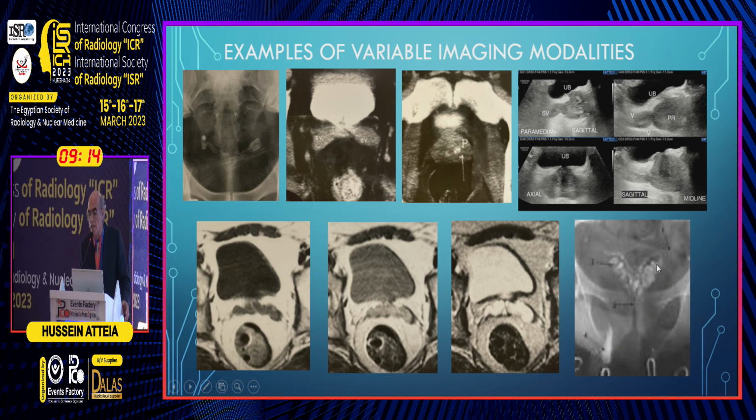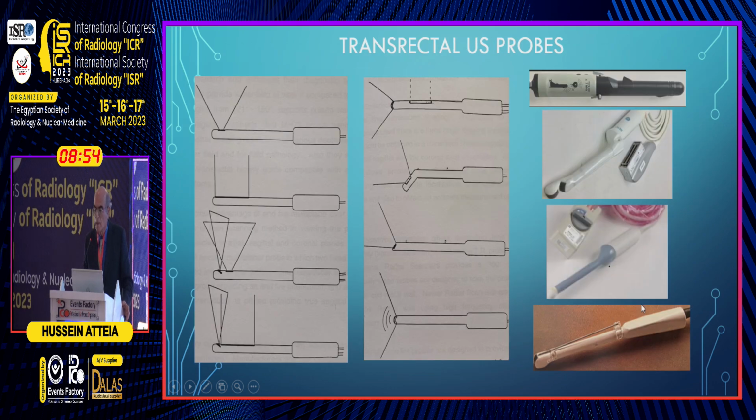And here, the ascending vasography, bilateral vasography, you'll see the seminal vesicles, and you see in between, I don't know where's the, okay. You could see in between, there you go. You can see in between the ductus deferens and the ejaculatory ducts.